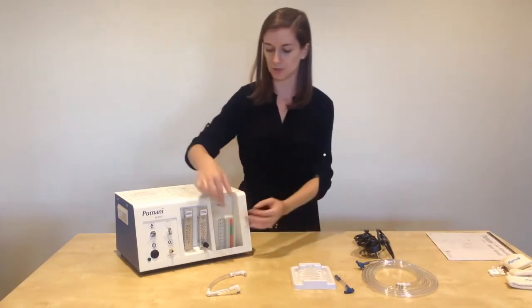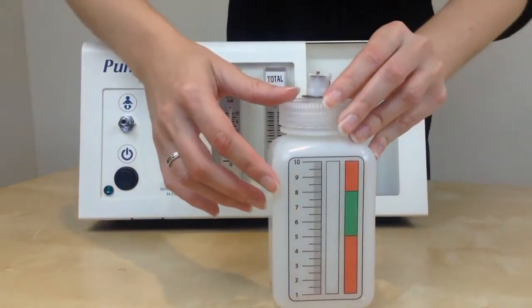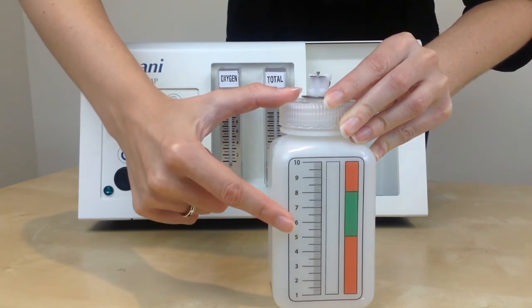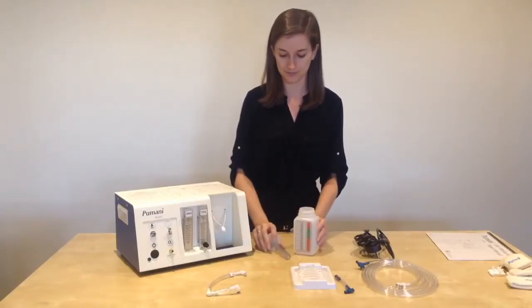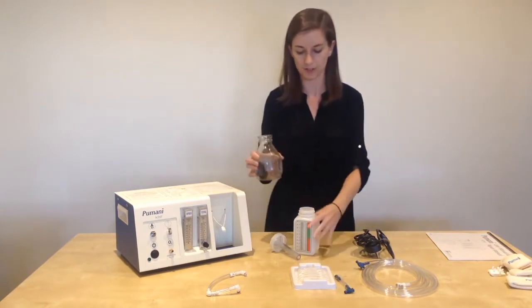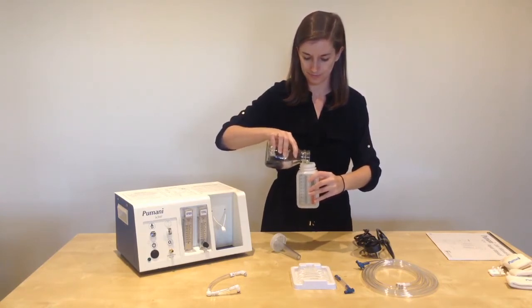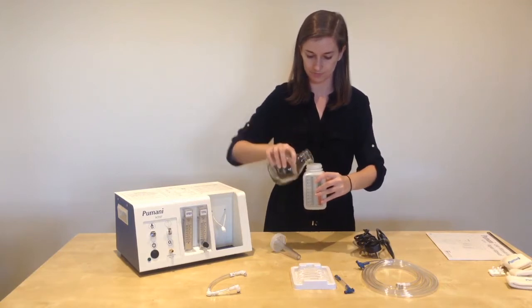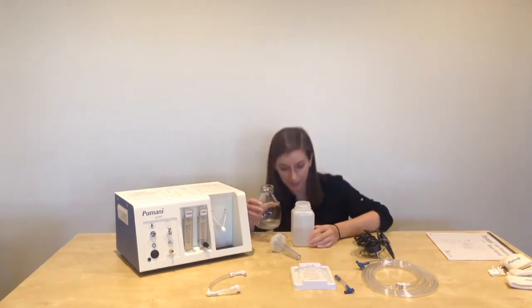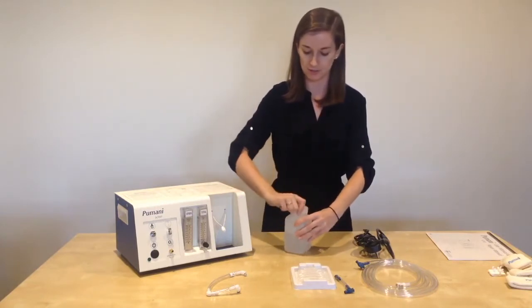The first step is to take your bottle and fill it to the set pressure level. Typically patients receive between 5 and 8 centimeters of water pressure. For this patient, we will start at 6 centimeters, where most patients will start. Remove the lid and fill with tap water or distilled water. To check the water level, put it on a level surface and check at eye level — this is at 6. Place the lid back on the bottle.